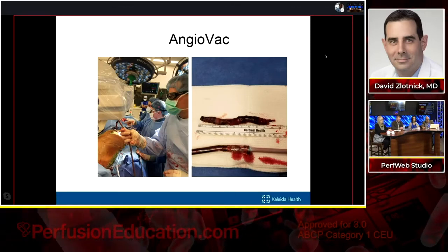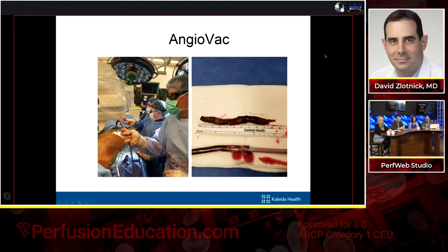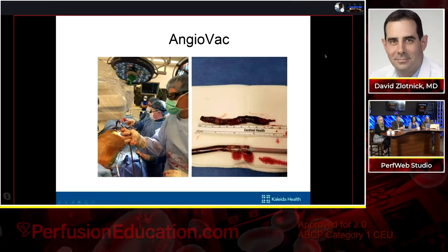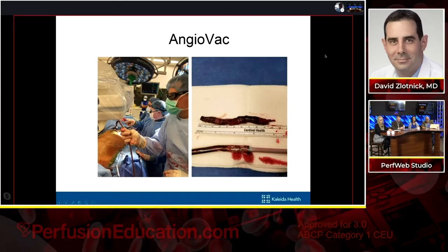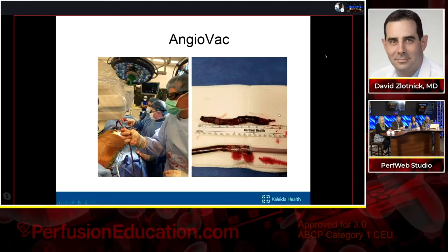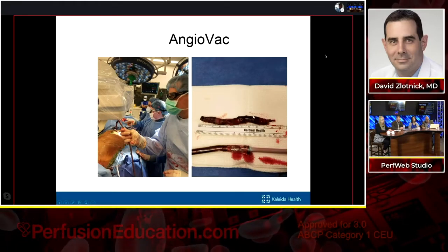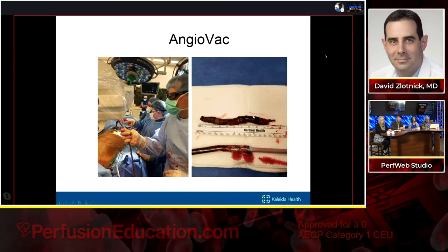So we knew that the clot had worked its way into the cannula, and I brought it out through the sheath, and you can see basically about a third of the clot was in the cannula with two-thirds still out, and everything kind of came out. And here's the tumbling thrombus. It was just under 10 centimeters, and you can see that the width of this was basically almost the width of the internal diameter of the AngioVac cannula.